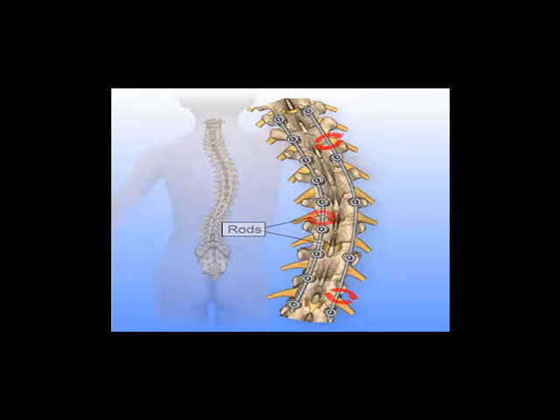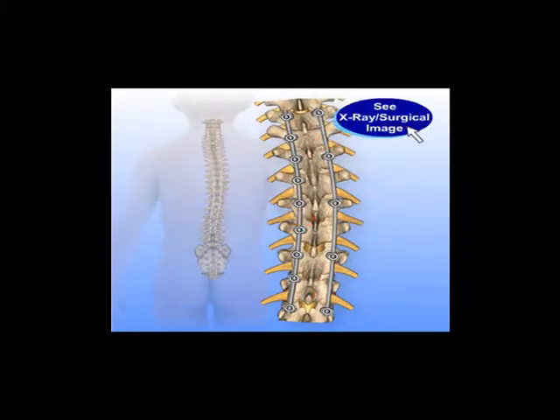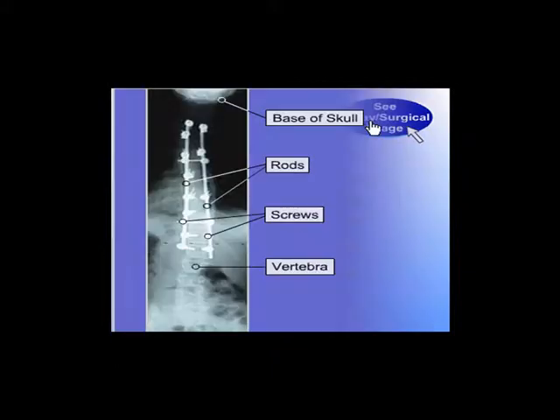The rods are then rotated in a fashion that straightens the spine. The rod and screw instrumentation prevents the vertebrae from moving while the bone graft fusion takes place.